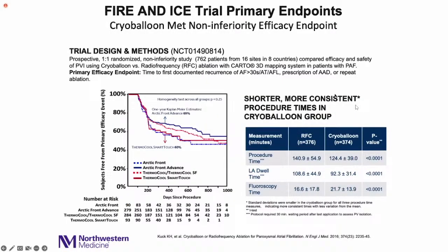And again, we've seen this many times, but the Fire and Ice showed the comparison of cryoballoon versus RF, which was problematic in this trial because the RF catheter evolved to contact force, and the cryoballoon catheter evolved to the second generation Arctic Front Advance. But in general, there was statistically no difference. So when patients ask me what's better, I will tell them that the trials show that RF and cryo are comparable.